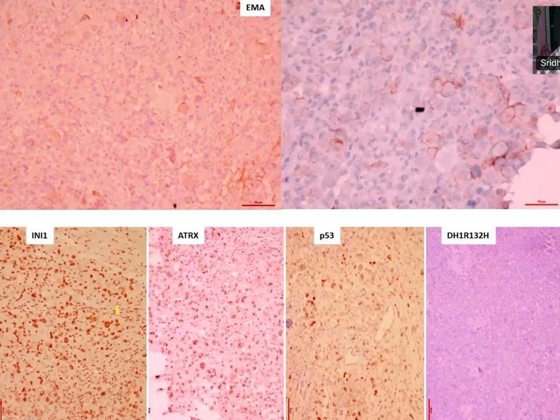Okay, it is here. So like other cases, we did IDH1, which is negative here. Okay, I is missing, sorry for that. P53 is strongly positive in at least more than 10% of cells. ATRX is retained, and because somebody told us about rhabdoid morphology, INI1 was done and is retained. So what do you want to call here? Anything which you want to suggest? So BRAF.